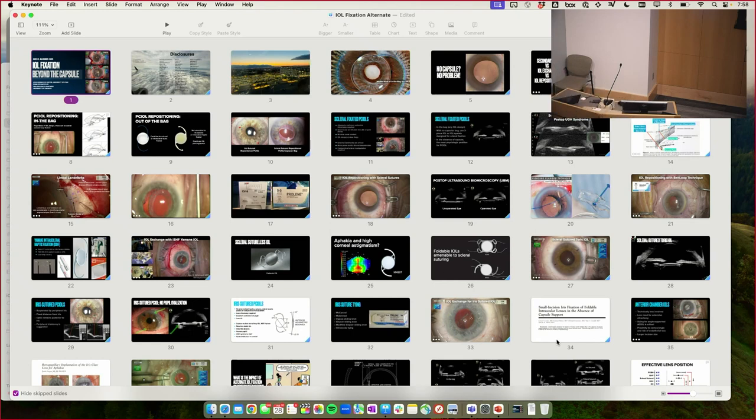Hey, Cole. Has Dr. Imani ever described having this in his own experience? I haven't seen anything published. No. You know, I think the main thing he used was a Hoya lens. Yeah. In Japan, that just hasn't had that difficulty or problem. Yeah. And it all has to do with staking, which is kind of an art form, staking that overall haptic. And it's just not made for when it's just sitting there passively in the sulcus, there's just a little bit of torque. Apparently, with the Hoya lens, they've just never had that problem.